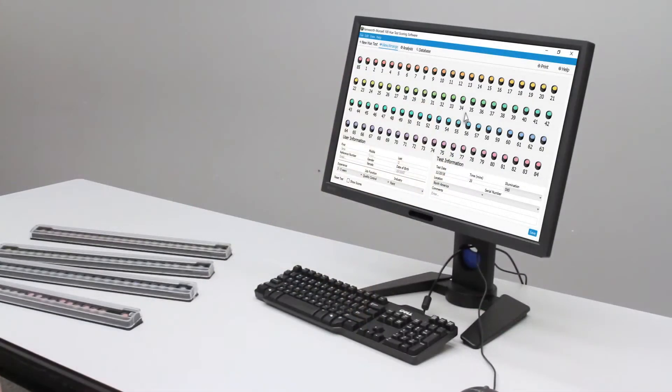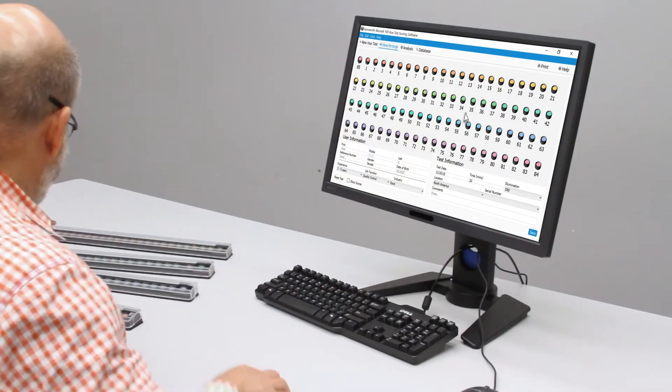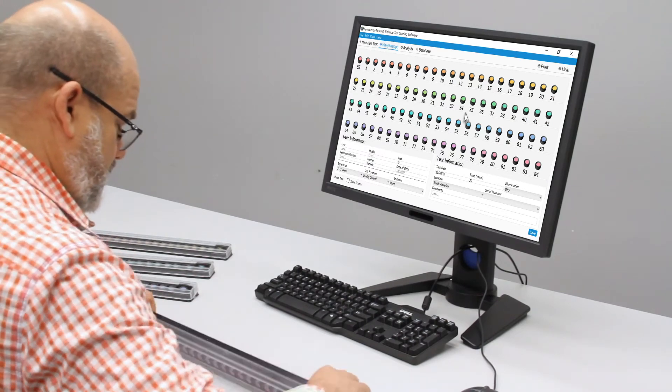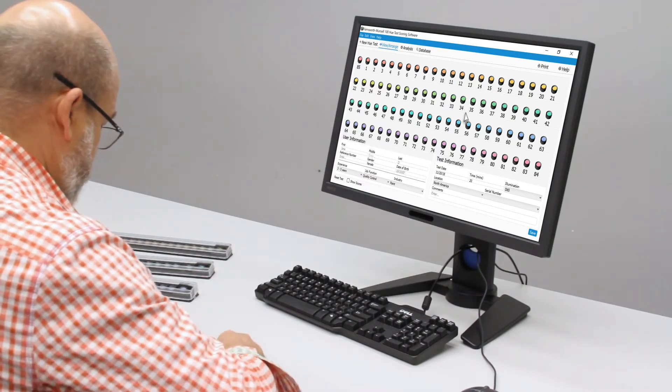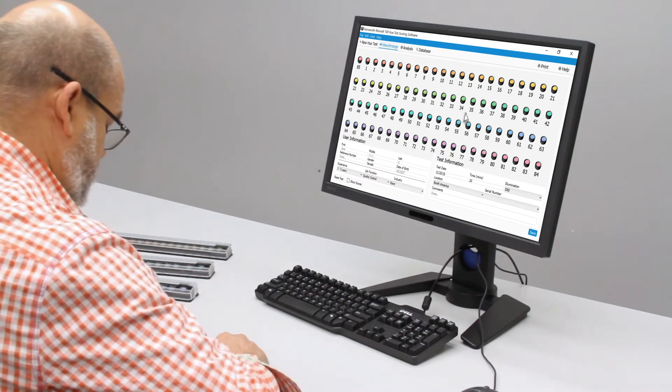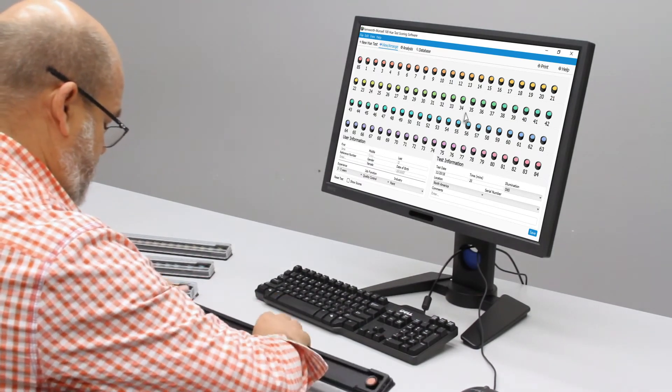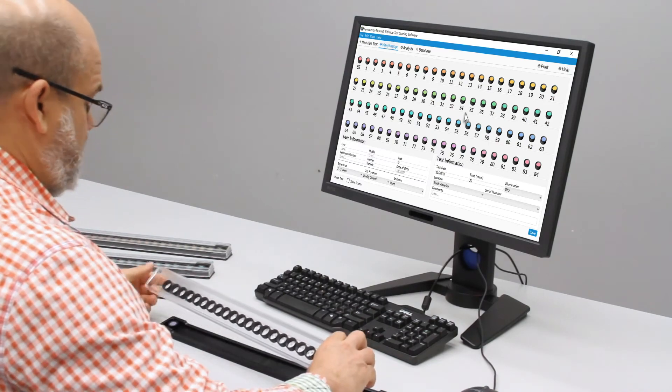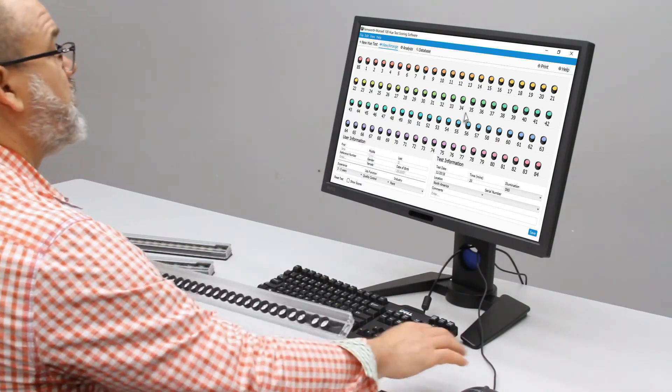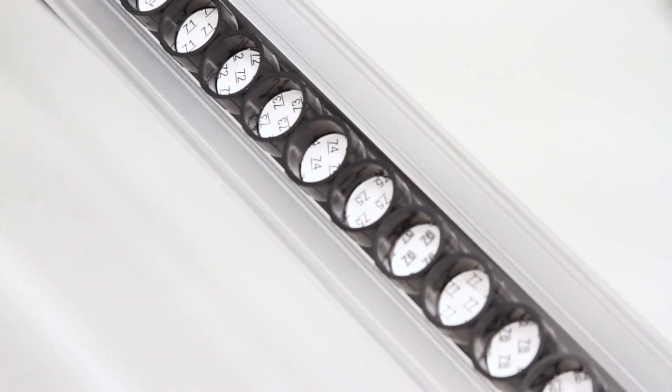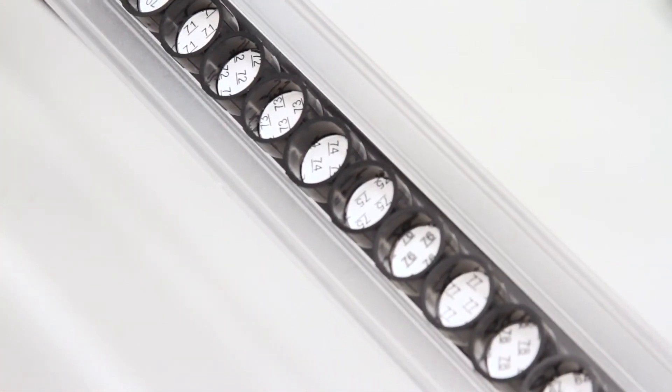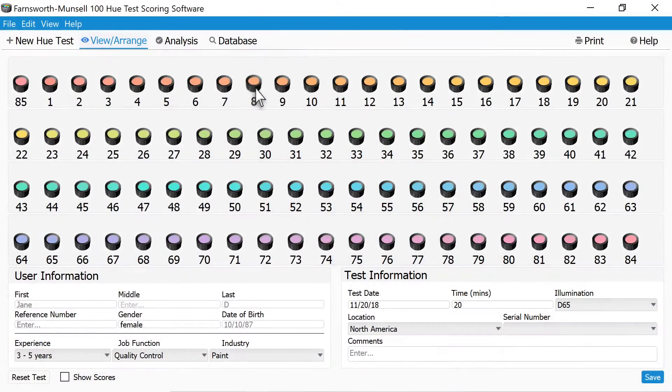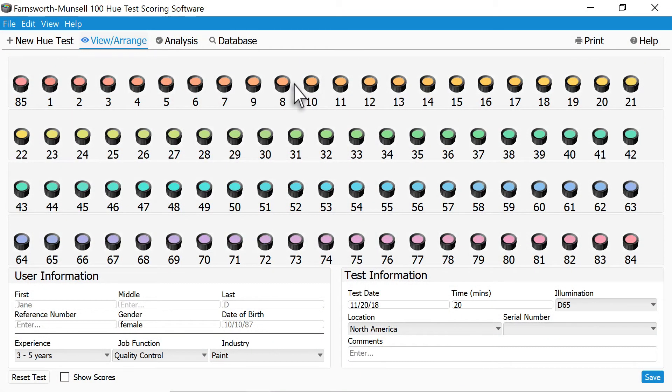The test is then scored using the included FM100 Hue test scoring software. To score the test, simply turn over the tray, lift off the bottom panel from the tray, take a look at the caps within the tray cover, and then arrange the caps within the software so that they match the order in the tray cover.